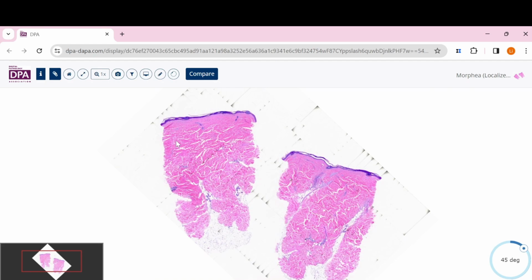We lose the fibroblasts between this collagen bundle in the dermis. That means we do not see a lot of nuclei here. Then we also lose the annexal structures. That means sometimes we may still see some vessels, but we do not have the eccrine gland. We do not find any hair follicle. If we find eccrine gland, it is usually just deep. They do not have it here.